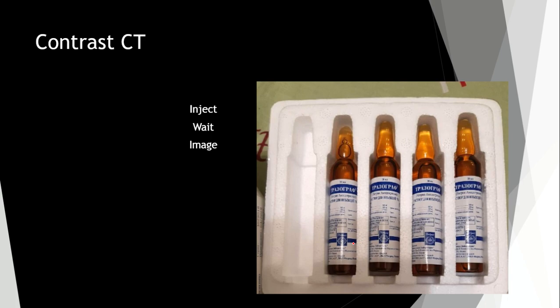Another very important way of imaging is contrast CT scan. First of all, we must inject our contrast intravenously, then we must wait some time, and then we must push on our CT scan and image our patient.